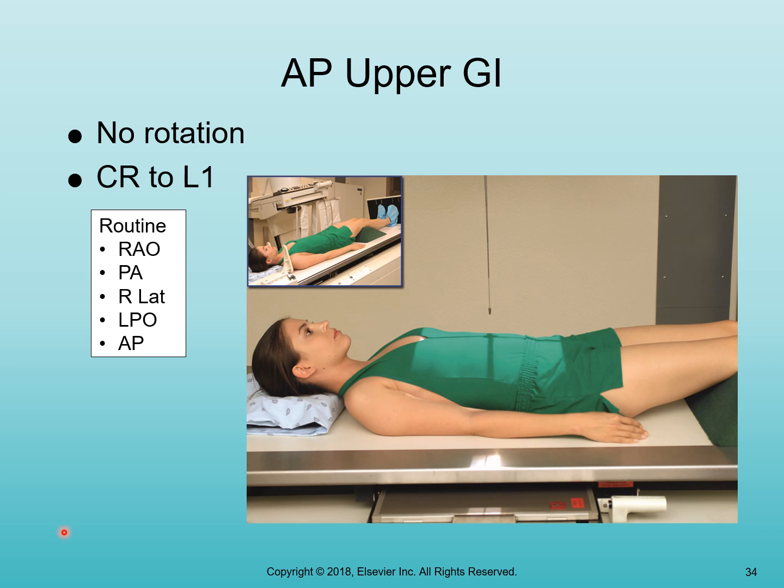They also reference midway between midline and the left lateral margin of the abdomen. But what I will tell you and show you is that you would position using what I call the W method. All right, and that doesn't really make sense until you see it, but you're basically placing your middle fingers.